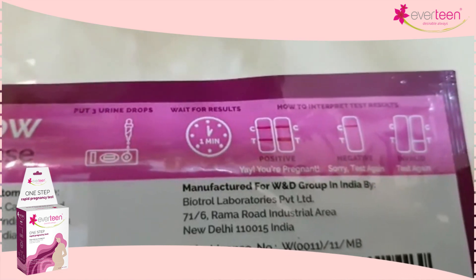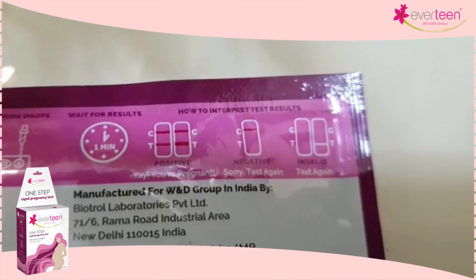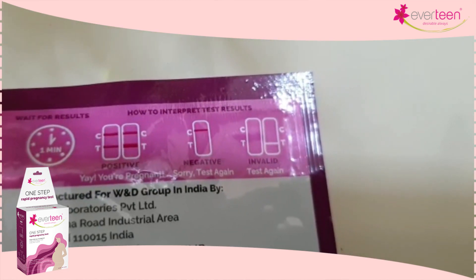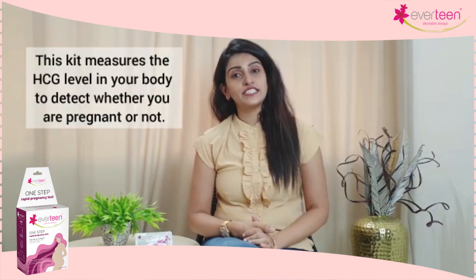If only one line is visible on the C section, that means you are not pregnant. And if no line is visible, or one line shows at the T section, that means the test is not valid and you should test again. The kit measures the HCG level in your body to detect whether you are pregnant or not.